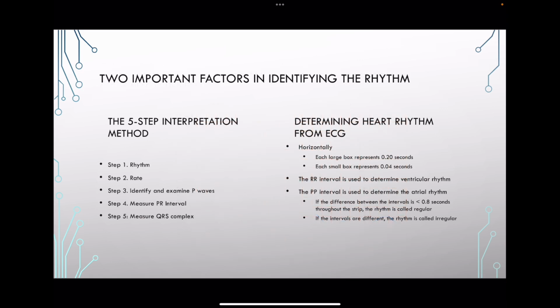Okay, so there's two important factors into identifying a rhythm. I talked about this in class, which essentially the first thing you're going to want to do is identify if your patient has a P wave.